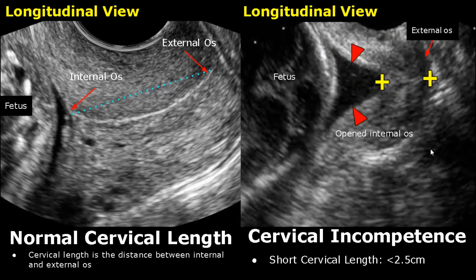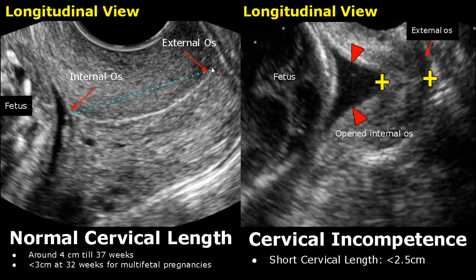Cervical length is the distance between the internal and external os. It is measured by placing one caliper on the internal os and the other caliper on the external os. The normal cervical length is around 4 cm until 37 weeks, and less than 3 cm at 32 weeks for twin pregnancies. A short cervix is suggestive of cervical incompetence, with a cervical length less than 2.5 cm.